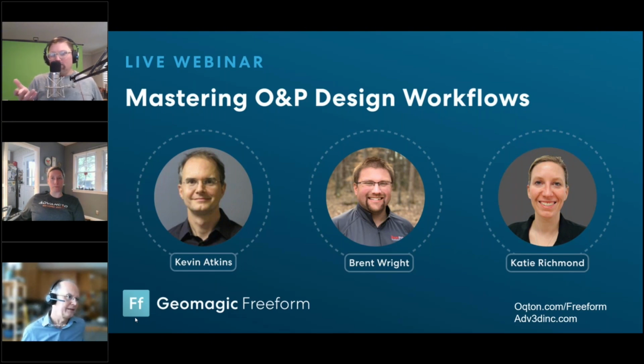Sorry, Brent. I would also say on that, you have to know what the inputs and the outputs are. You can't just go straight to a Dynabot, or you will literally be lighting money and time on fire. The BK socket is a beautiful Dynabot, but it represents like 6 years worth of pain and anguish through the Mesh Mixer Fusion 360 workflow, trying to figure out what tools work in Freeform. So it's important that you know those two before you dive into the Dynabot.